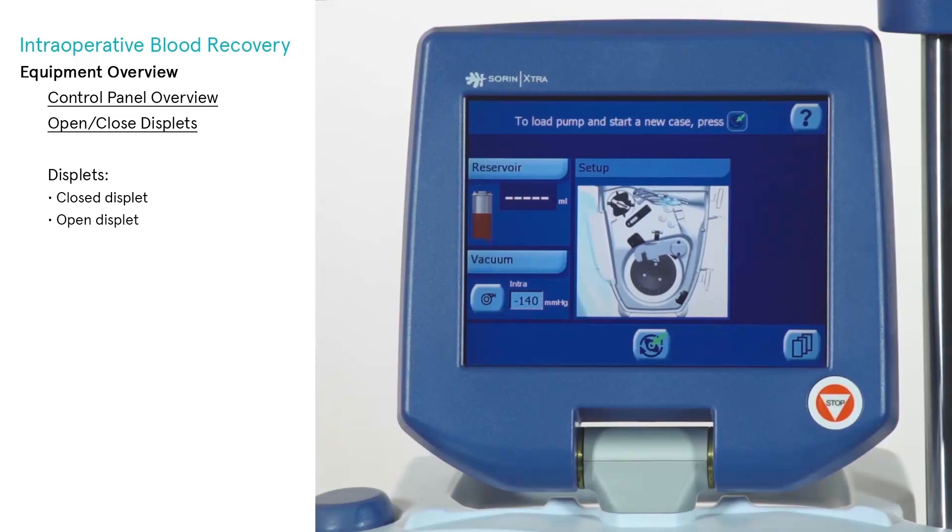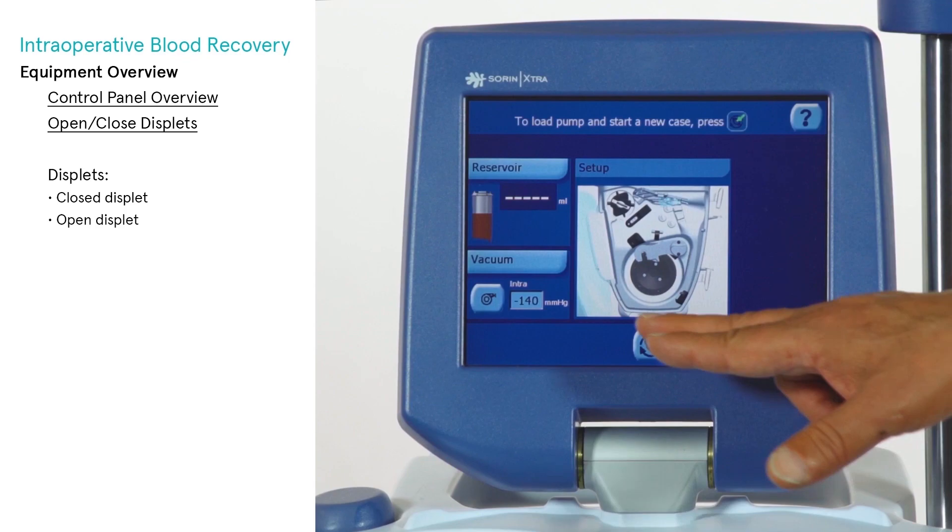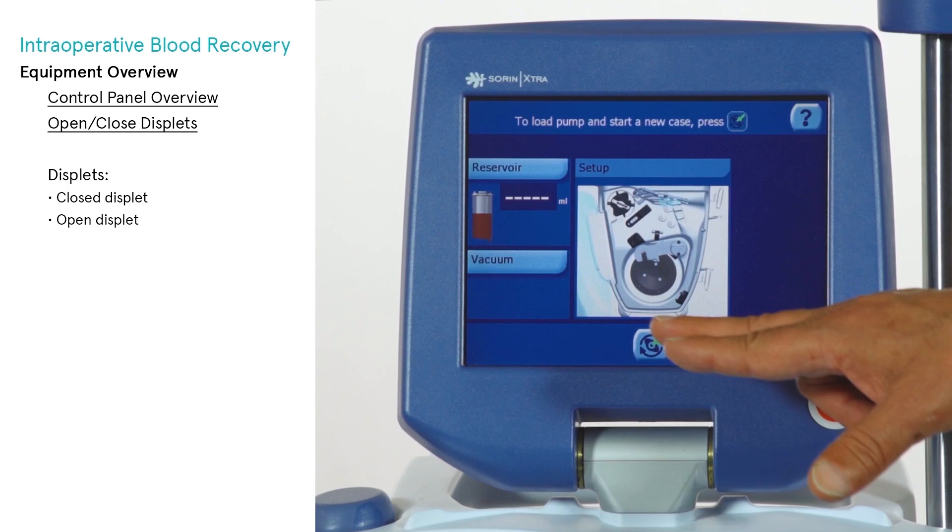A displet is a display applet which may be independently opened or closed. A closed displet has its content hidden, while an open displet's content is visible. Pressing the title bar of a closed displet opens it; pressing the title bar of an open displet closes it.